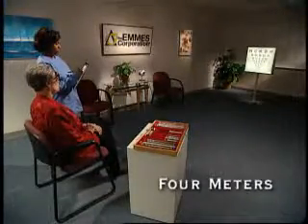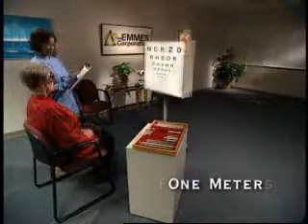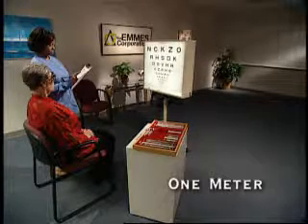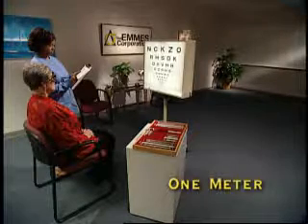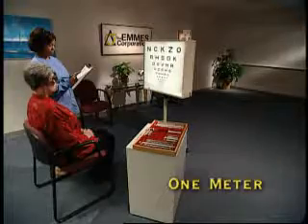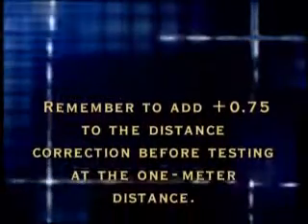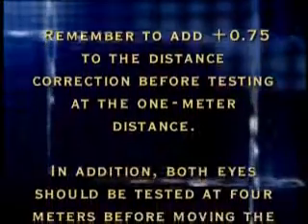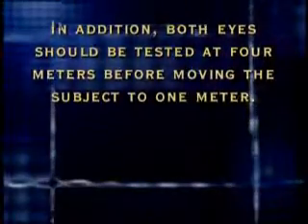begins at 4 meters. However, those eyes that have been compromised by disease may need to be tested at a closer distance. For all studies, this is a 1 meter distance. Vision testing at 1 meter is necessary only when the subject reads fewer than 20 letters correctly at the 4 meter distance. Examiners must remember to add plus 0.75 to the distance correction before testing at the 1 meter distance. In addition, both eyes should be tested at 4 meters before moving the subject to 1 meter.